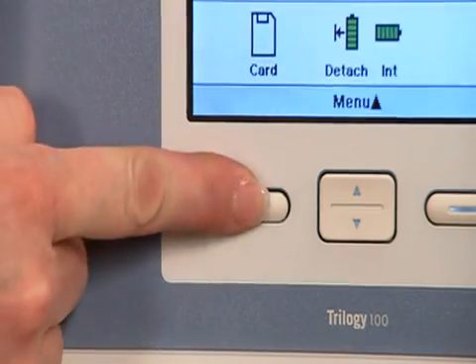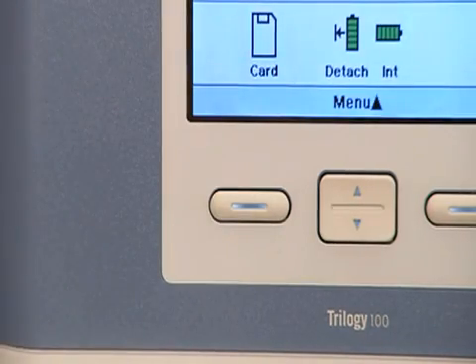When the problem is corrected, the alarm LED, audible alarm, and the alarm background color will shut off. However, the alarm text remains on the screen until you press the left button to reset the screen.